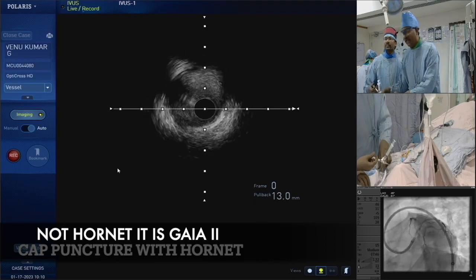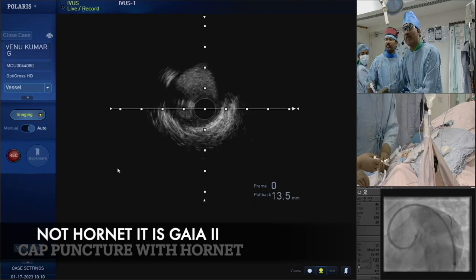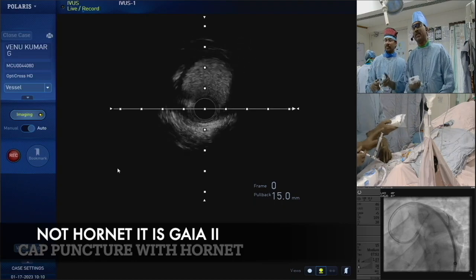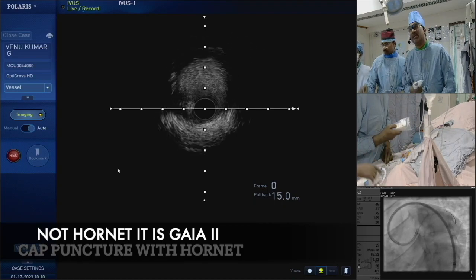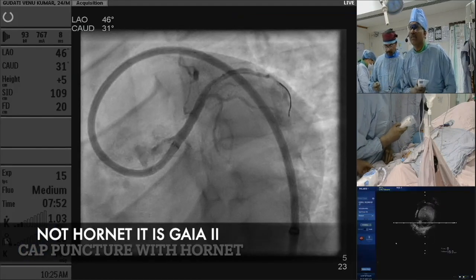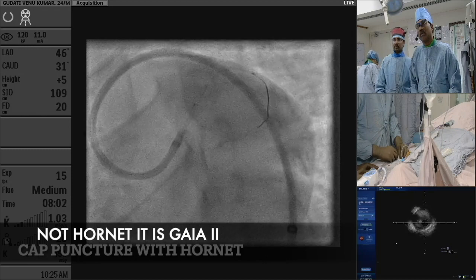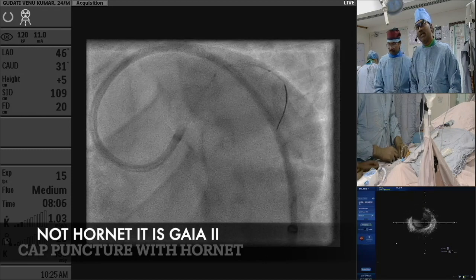That's just gone in. Just give me Crusade, please. So this is a Crusade on the same wire.